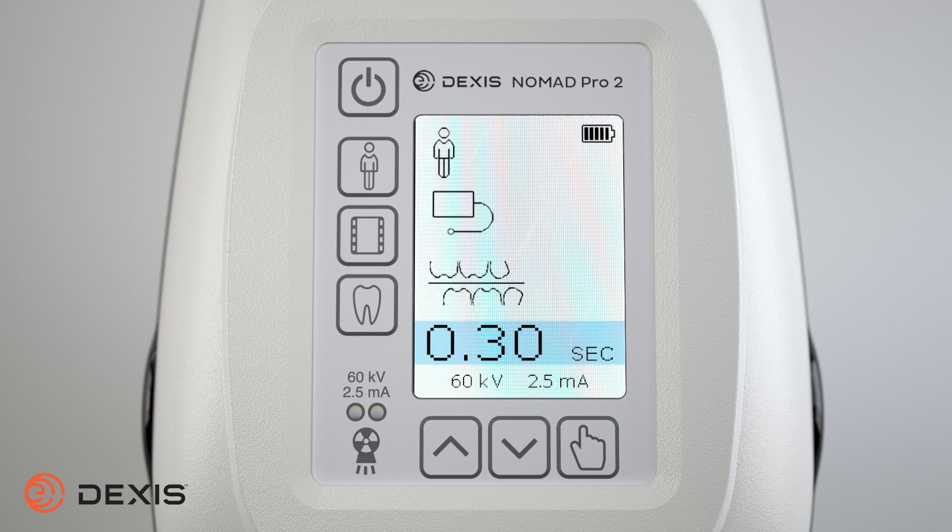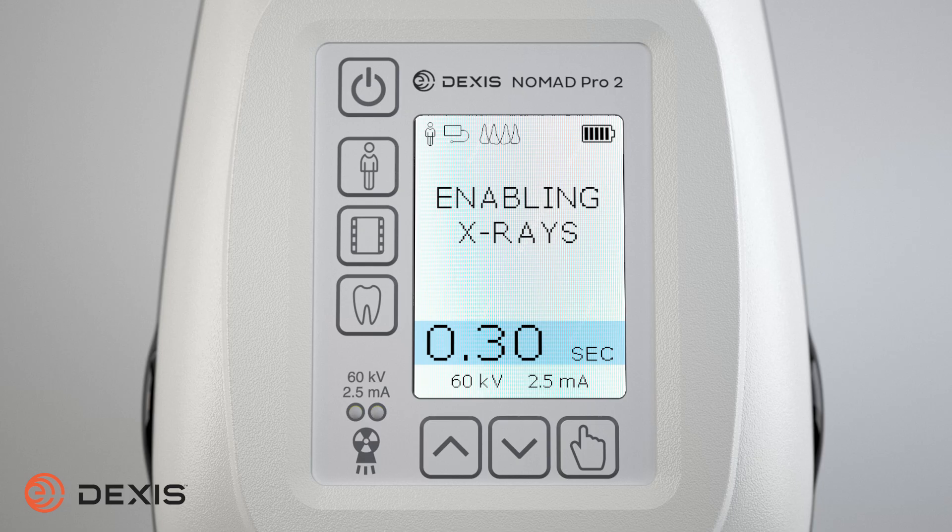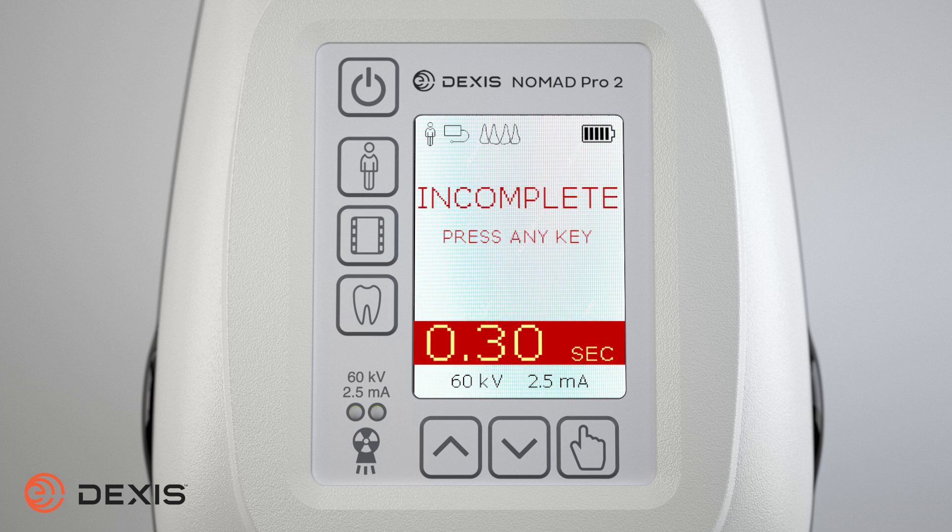Before preparing the Nomad, you should properly position and protect both the patient and operator. Press and release the trigger once to ready the device. The device will briefly display an enabling x-rays message before indicating ready. You will know the Nomad is prepared to fire x-rays when the green LED illuminates, the ready message appears on the display, and you hear a double tone alert. The ready state continues until an exposure is detected or timeout occurs. After 15 seconds of inactivity, a double tone sounds and the device returns to settings mode. As a safety precaution, if the trigger is held longer than one second while still in the enabling x-ray state, the device will not transition to the ready state. The ready state will also fail if the trigger is pulled a second time while in the enabling x-ray state, to prevent accidental activation.